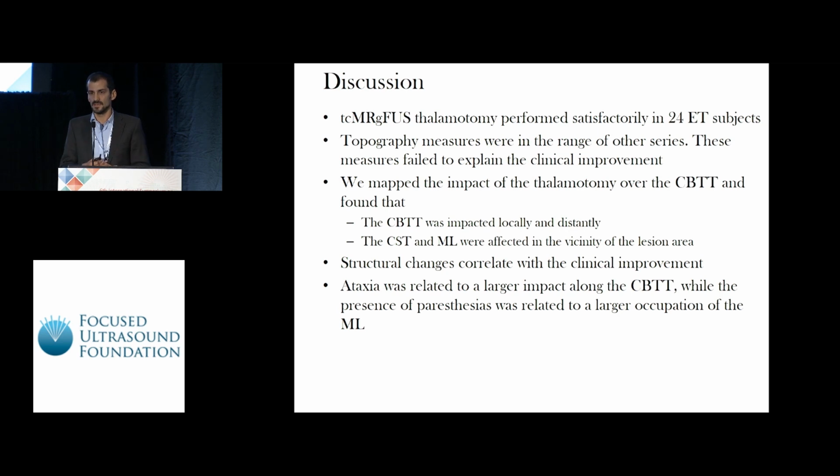We have mapped the tracts, and we have seen that the impact on the cerebello-thalamic tract is related to the improvement of tremor, but it could be also related to the presentation of ataxia. So we must impact on this tract, but be careful with the side effects.